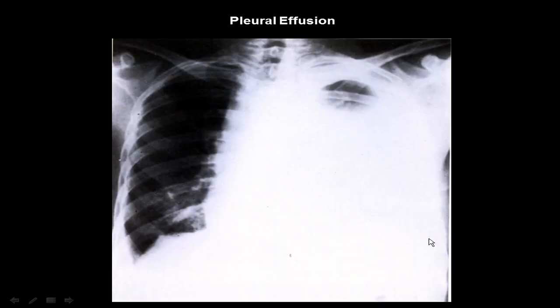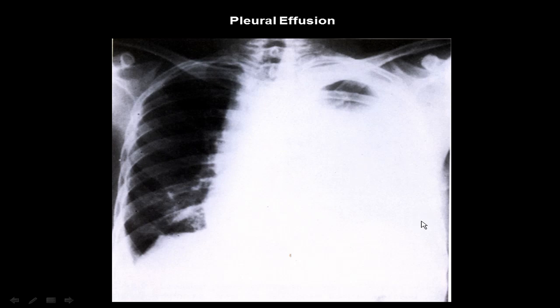A massive pleural effusion on the left side — obliterating and compressing the whole lung; only the apex of the left lung is clearly demarcated — with shifting of the mediastinum, which is the heart and the trachea, to the other side, and obliteration of the costophrenic angle. Of course it's a massive effusion on the left side.